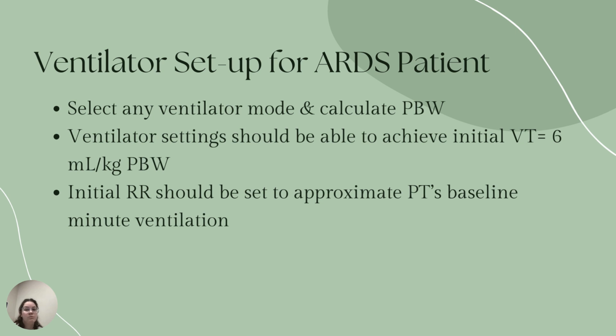And then that's the end of this video. So just to summarize, we went over the inclusion criteria for ventilated ARDS patients, the ARDSnet protocol, and that's going to be all acute onset symptoms. And then we also went over your initial ventilator setup and what adjustments you can make based on what numbers we want to keep it around.